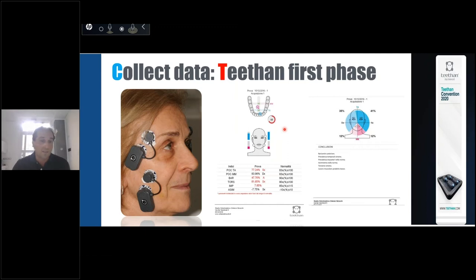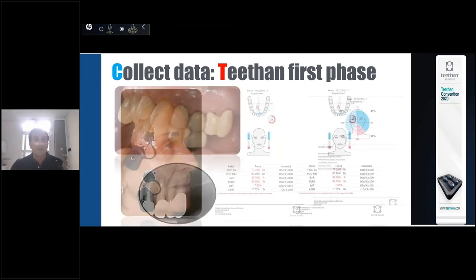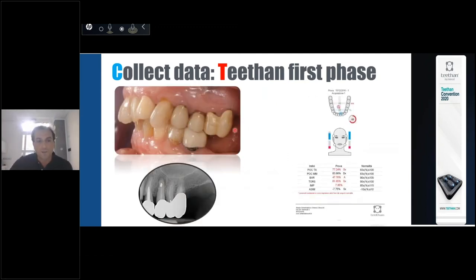Now, this is the first visit. Now I changed something. I did some therapies inside the mouth. She can't bite very well because she has a problem in the other part of the mouth, so it's impossible to have a good exam in this phase, but it's important to have. In the first visit, I always want this type of exam. Now, the impact is so low, it is a strange situation.